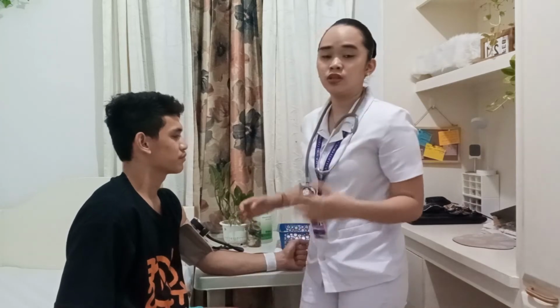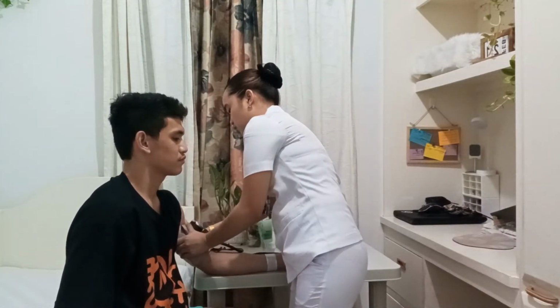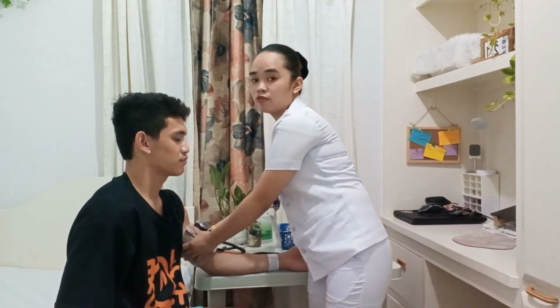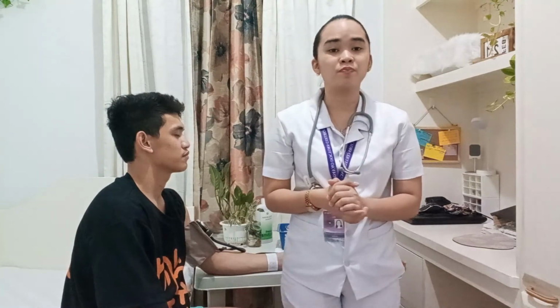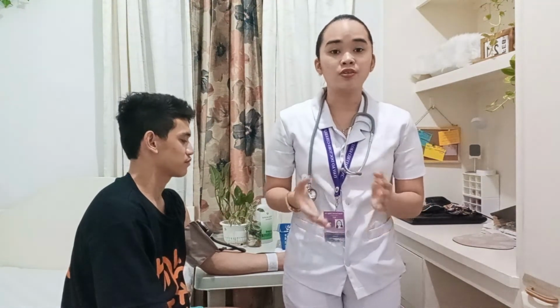Okay, now I will deflate the cuff, and I have taken his initial systolic pressure, which is 110 millimeters of mercury. Now we'll wait for about 2 to 3 minutes before taking further measurement, because the waiting time will give the blood that is trapped in the veins enough time to be released.